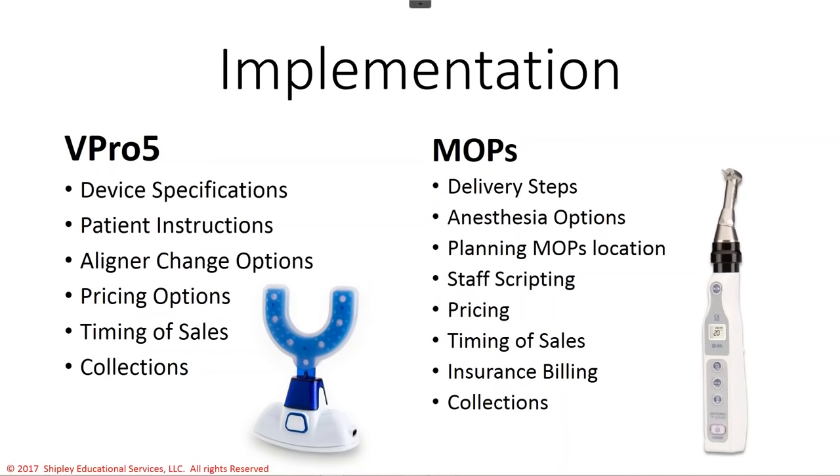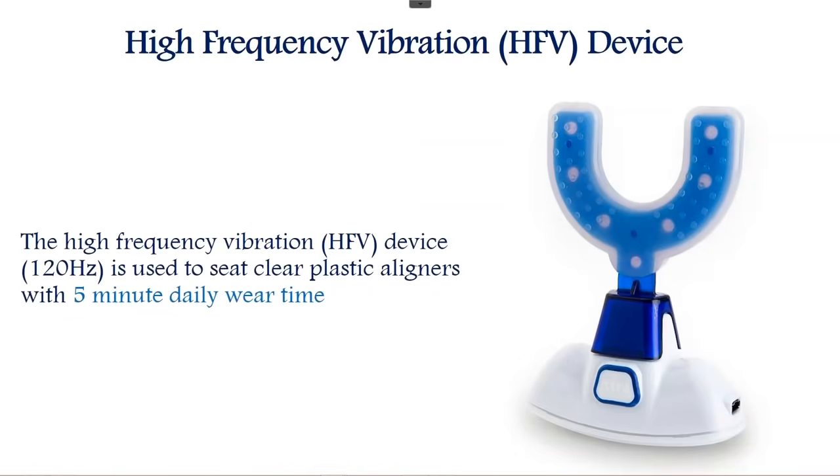So we're going to talk about the device specifications, patient instructions, the options we have for changing the aligners with my preference. Then we'll talk about pricing options, timing of sales, and then collections, because that's always a question that I get. So what are the specifications?